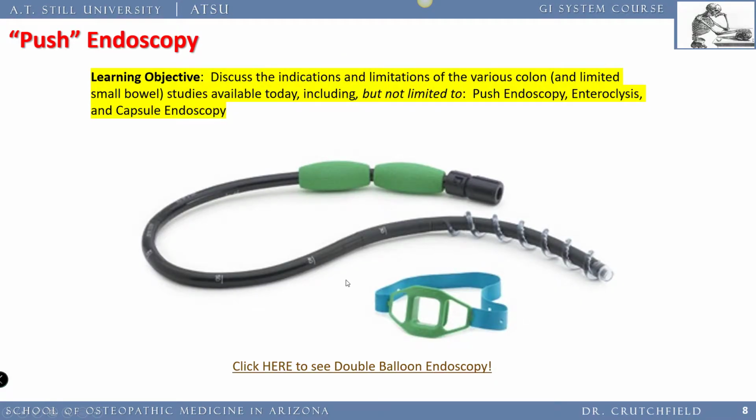So this is push endoscopy. This is an endoscope that has two balloons on the end of it. And let's see how this is used. Hopefully I can bring this video up and it'll show.